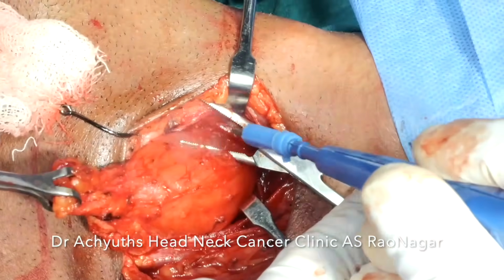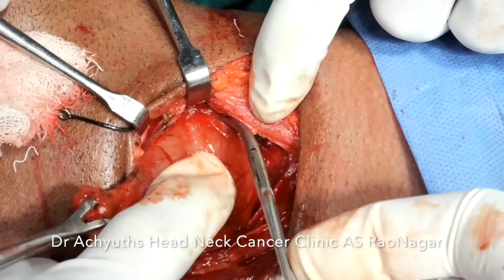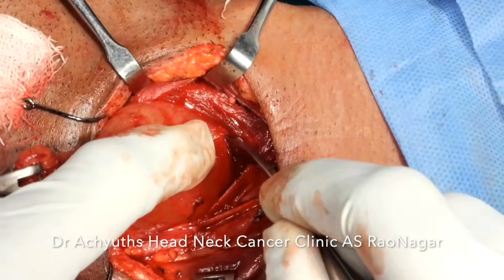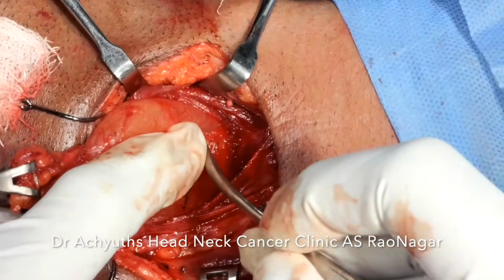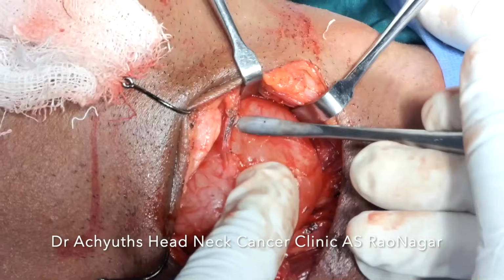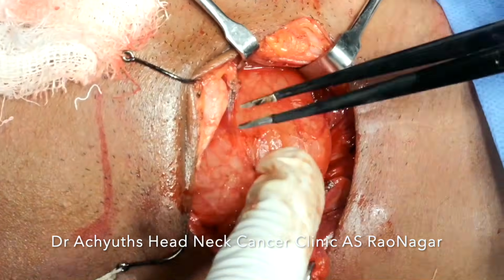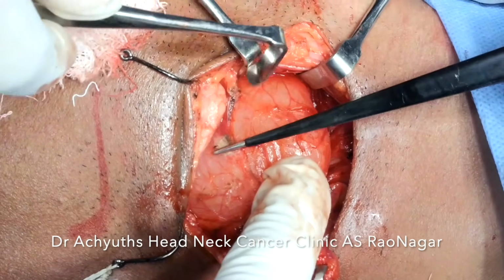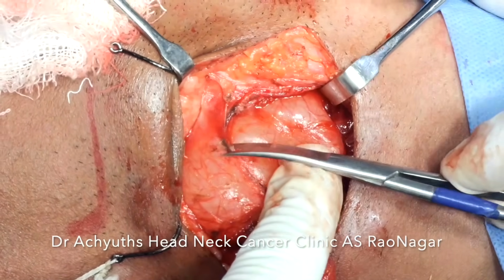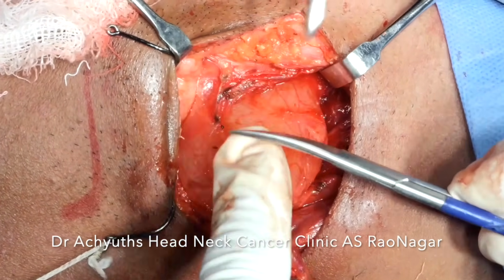You just insinuate the mosquito forceps and release the fascial attachments. Again, this tonsil elevator becomes very handy sometimes. So only patience and careful dissection.